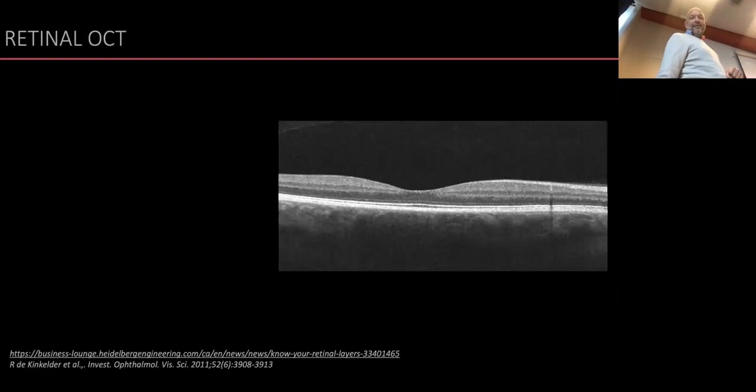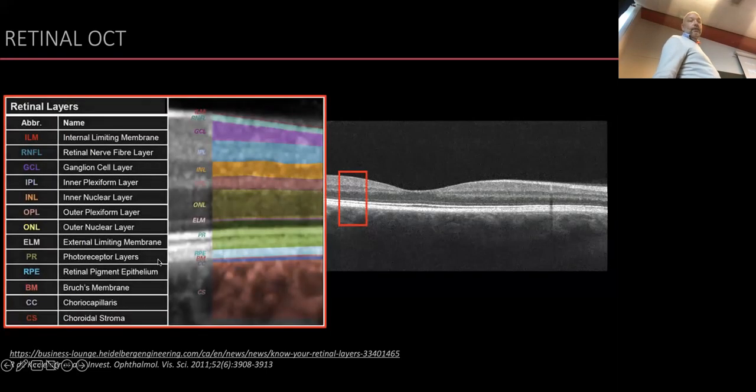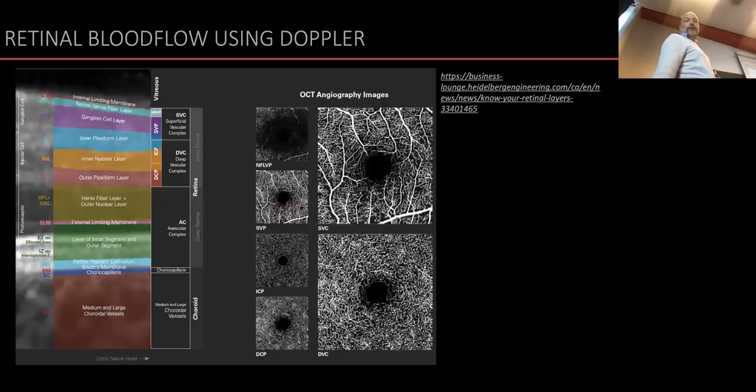Yeah, it's an old presentation, but these are the type of data sets that we use to make. And again, all these several layers are visible in a retinal OCT data set. And if you look at the Doppler shifts, you can build up what we call an angiography image, and you can suddenly show all these tiny blood vessels there and the whole network. And I guess the take-home message here is that besides making pretty images, on top of that, you can get what we call functional information by studying the interaction of light and tissue. In this case, looking at the Doppler shift.